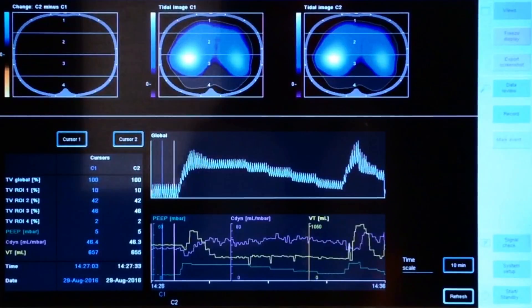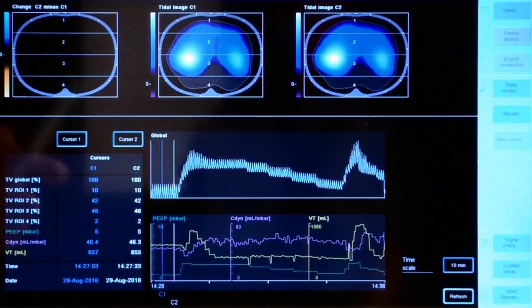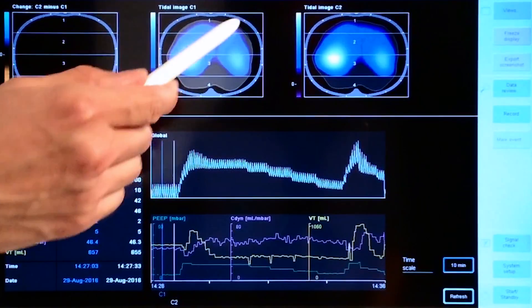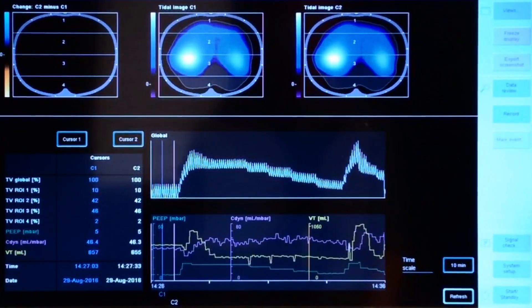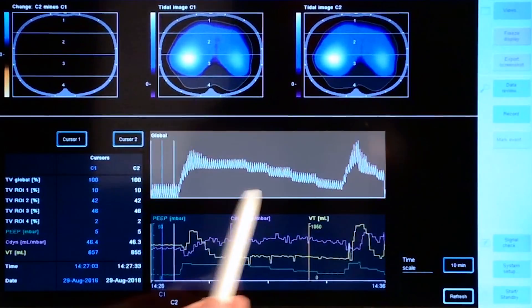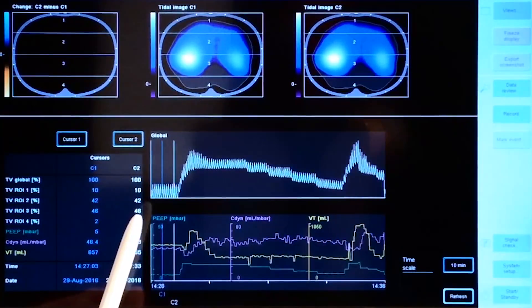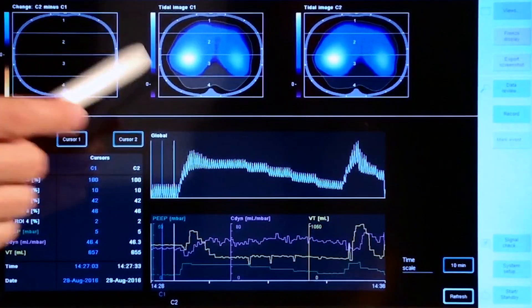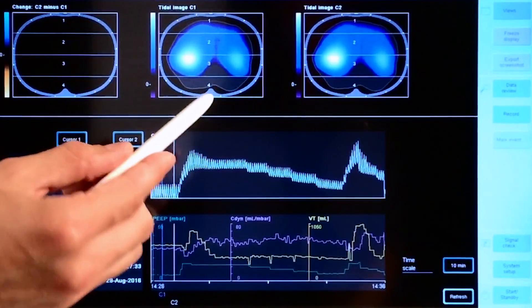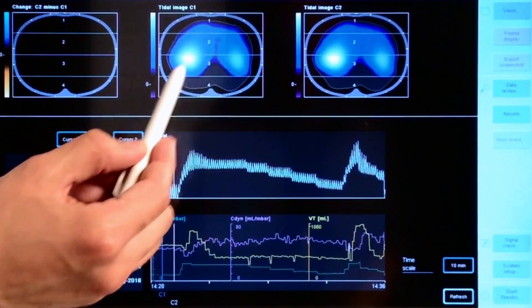The gray shape represents the contour of the ventilated area, which detects all pixels that could be ventilated during the displayed time period. This gray region indicates that there is no ventilation taking place.